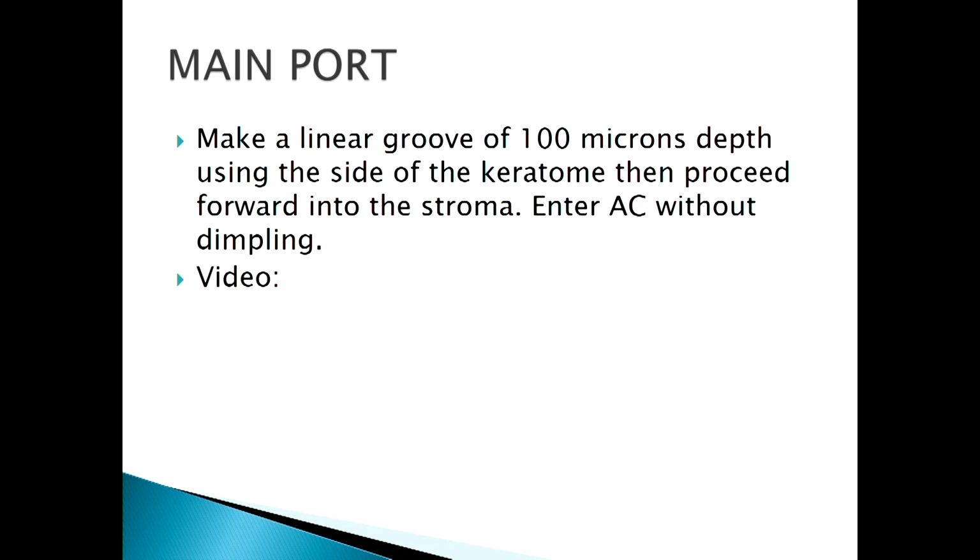Let's move on to a video just showing an ideal main port. You make a linear groove of 100 microns depth using the side of the keratome, enter the AC without dimpling.